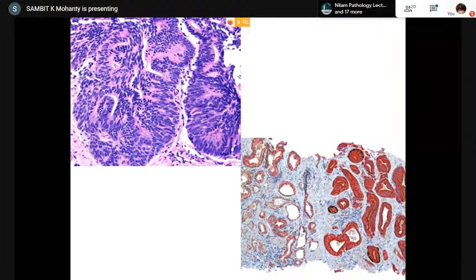The cells are pencil-shaped cells. The nuclei are really dark and they're pencil-shaped. They look like endometrioid carcinoma. They're cribriform, and there are stacks of nuclei next to each other, making stacks. So what is it? Is it acinar adenocarcinoma or not? This is prostatic ductal.